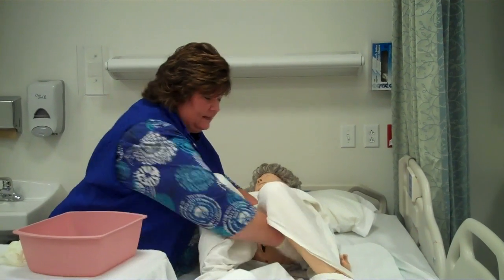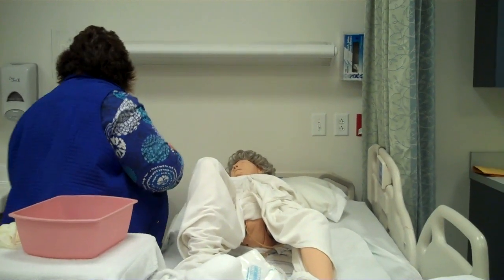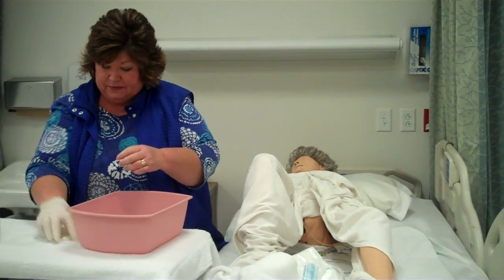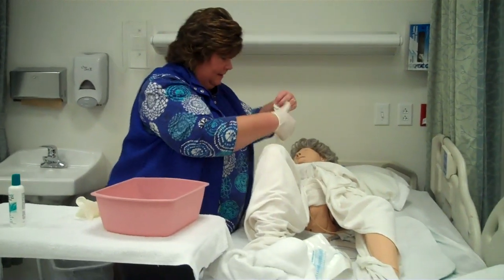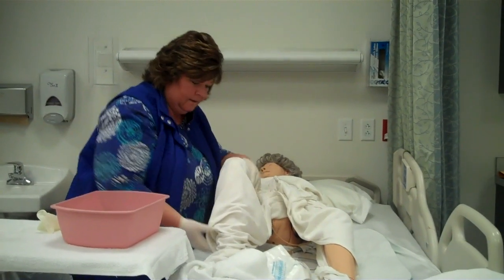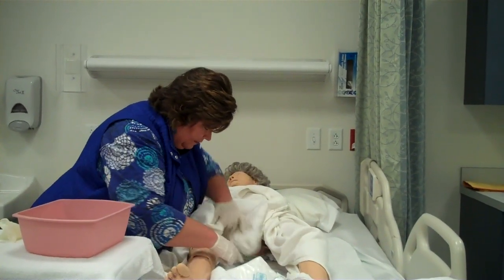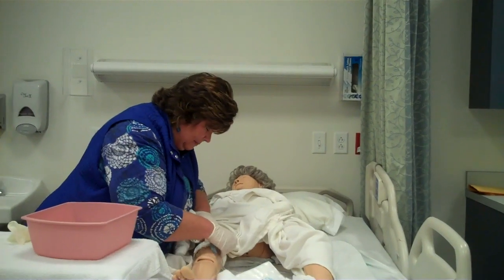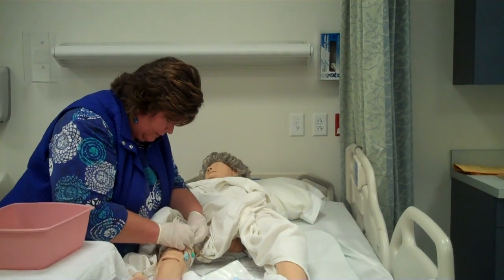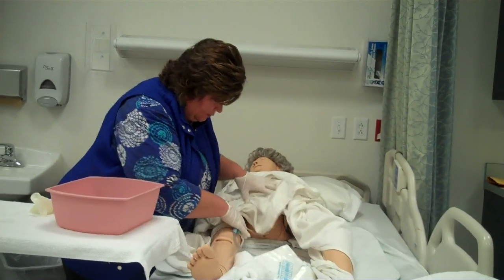Mrs. Smith, let's get your legs straight here. Before I change your pad, I'm going to remove my gloves, decontaminate my hands, and put on a fresh pair of gloves. Before I remove the pad, I want to put the catheter back into the leg strap to anchor it so that we're not pulling it as we turn her. Each leg strap is a little bit different, but they're pretty easy to figure out. Most of them are of a Velcro fashion. You want to make sure there's some slack there, and we anchor it right close to the Y part of the catheter.